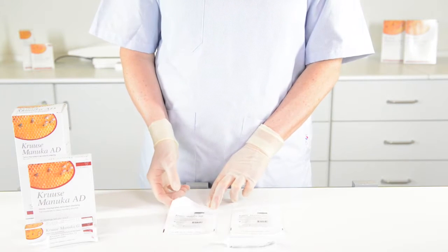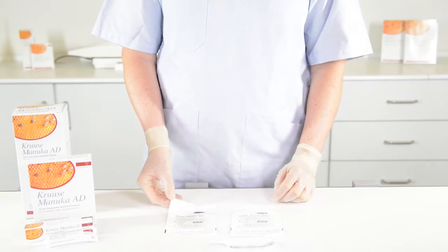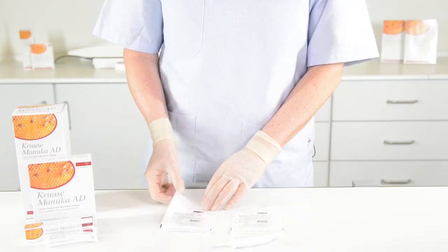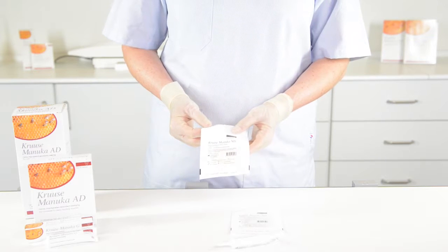These are the Kruse Manuka honey products. We have three kinds of products: the ND, the AD, and the gel. We will start with the ND, which means non-adherent dressing.